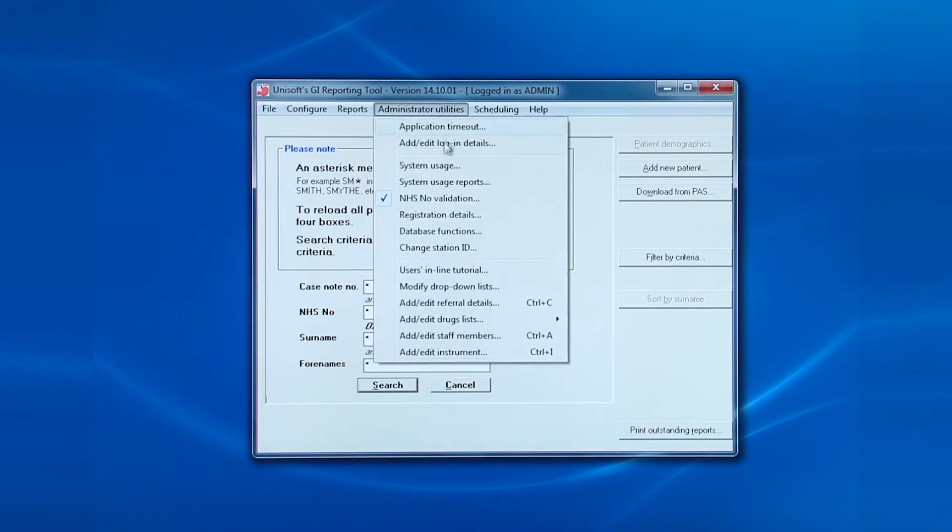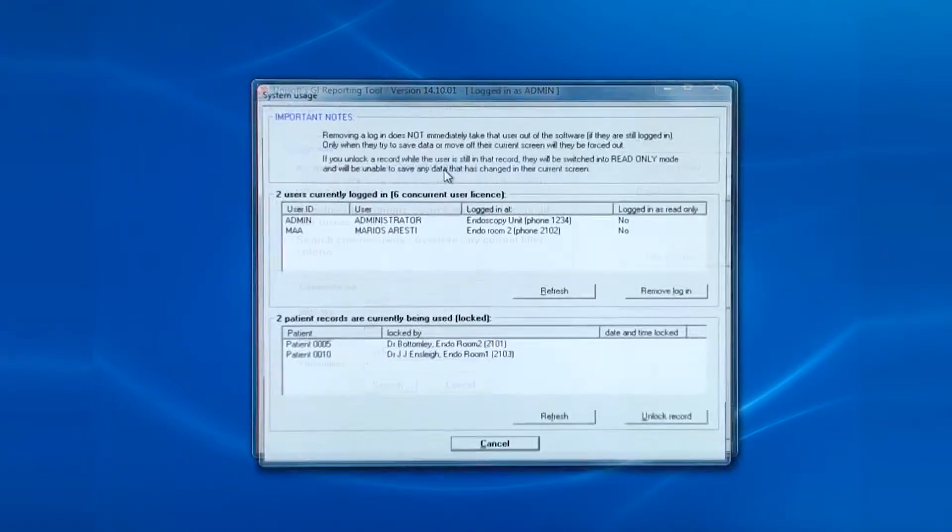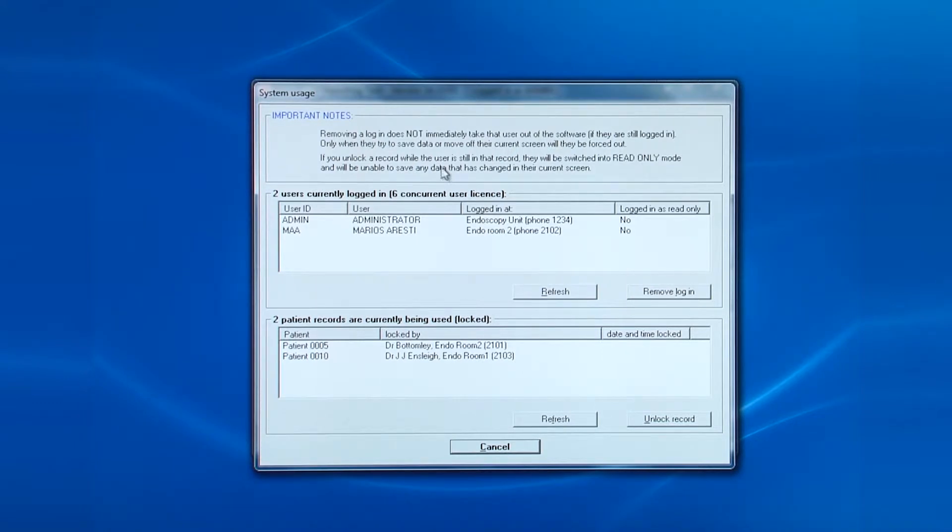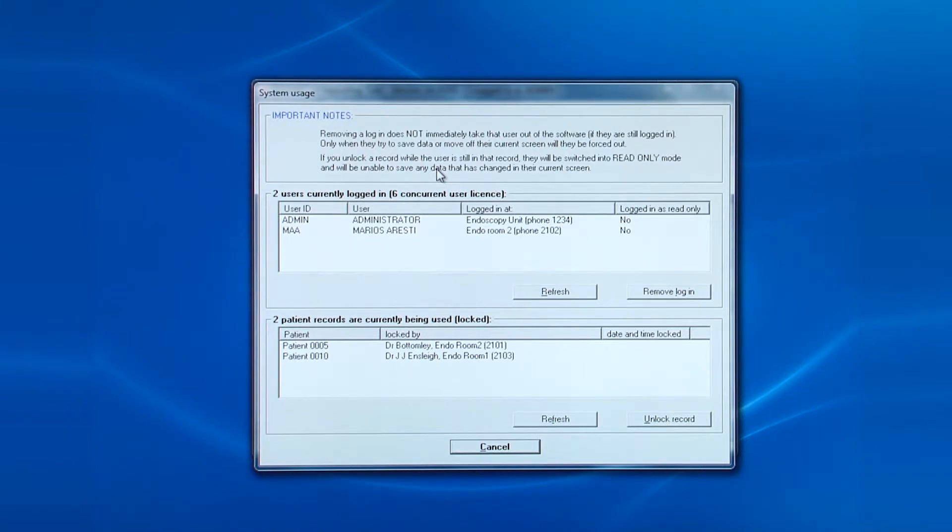Next, we're going to look at system usage. This tells you who is logged in and who is working on which patient records. This is a useful screen if, for example, the software has stopped abruptly.